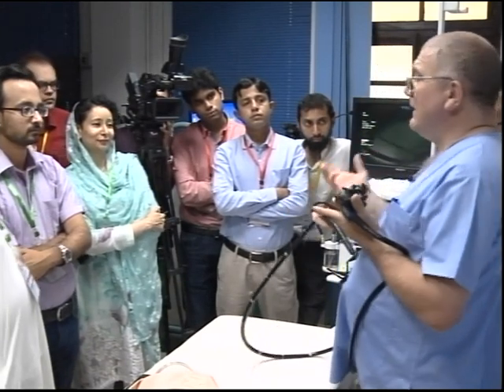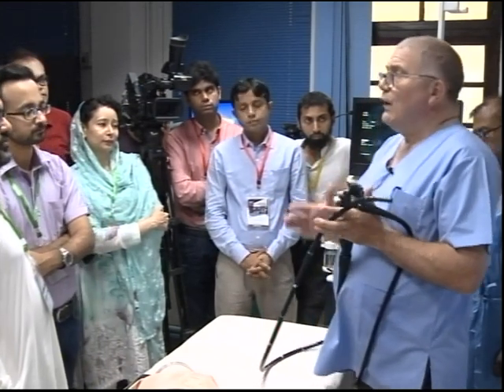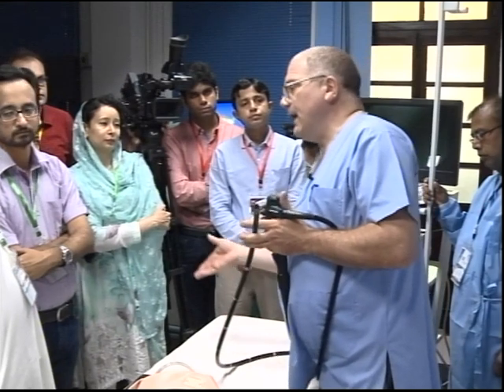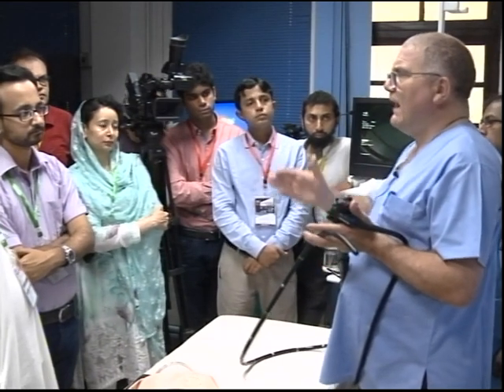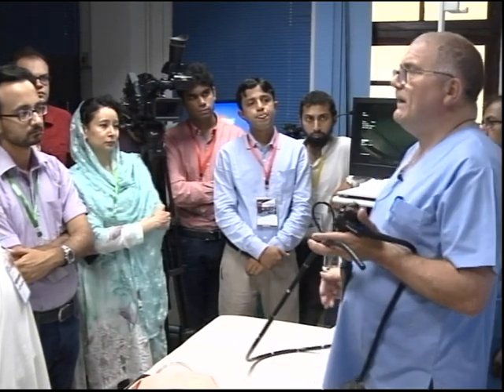Reason why I get you to do this is that you need to be aware of your equipment. You shouldn't be using... Would you get in a car that was leaning over to one side and dipped down to the front and drive it? What could be the problem if you get back to your car and your car is now shaped like this? What could be the problem?